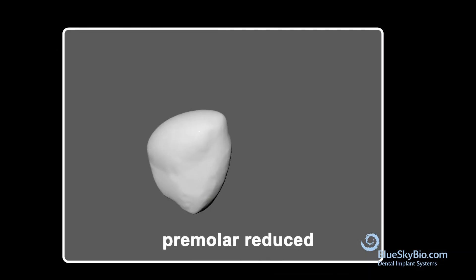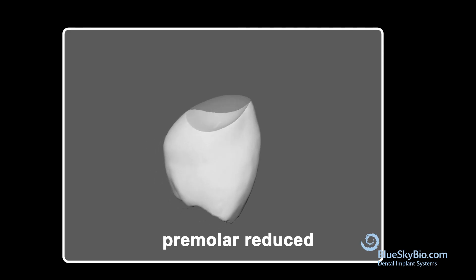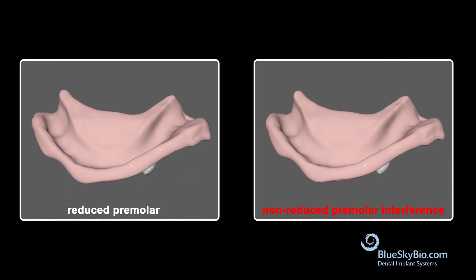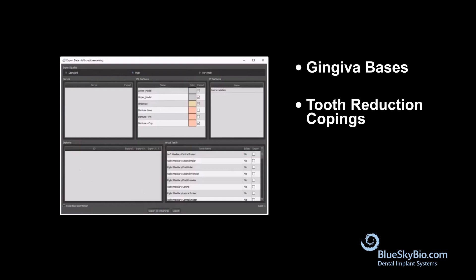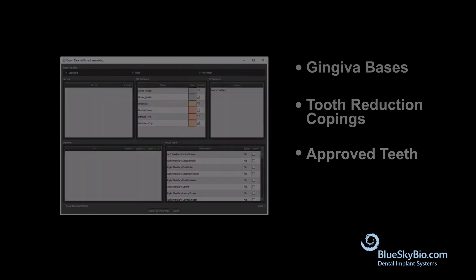The denture module will automatically reduce the teeth in approved teeth libraries to prevent intersection with the dentureless models. All manufactured gingival bases, tooth reduction copings, and approved teeth can be exported from the Blue Sky Plan software to STL files for milling or printing.